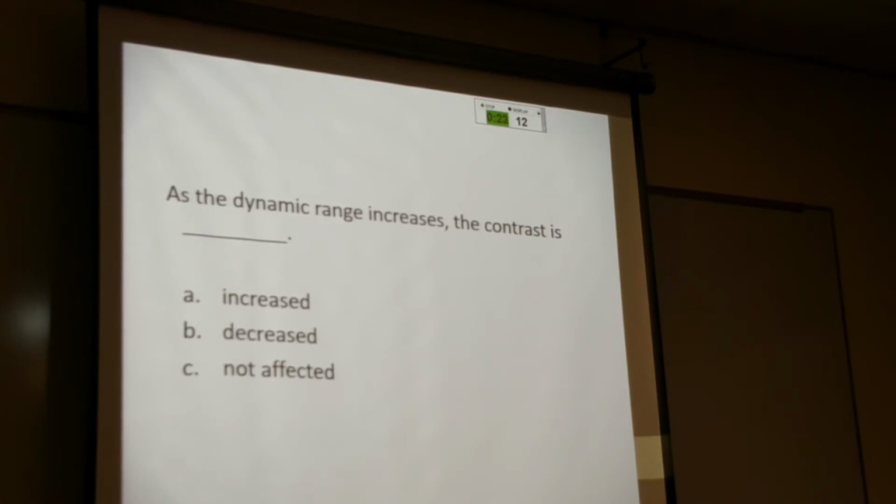So now here's the word contrast, not contrast resolution. If you can see black and white and many shades of gray in between, how does that describe the contrast? Low contrast.